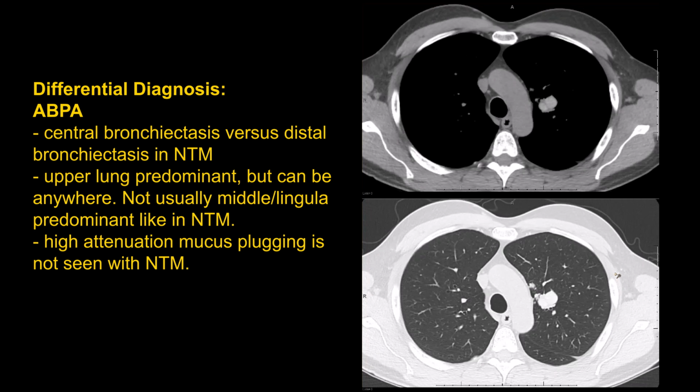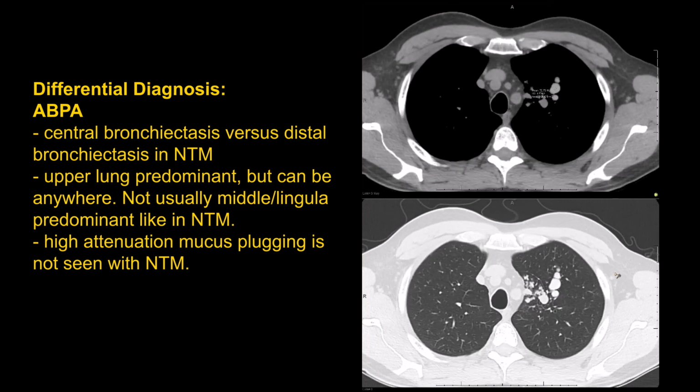And then finally, that finding I mentioned of high attenuation mucus plugging is a pretty specific sign that indicates that this is a fungal etiology, and in particular, ABPA. That's not something that you'll see in patients with NTM.